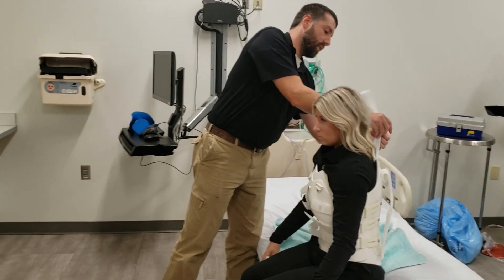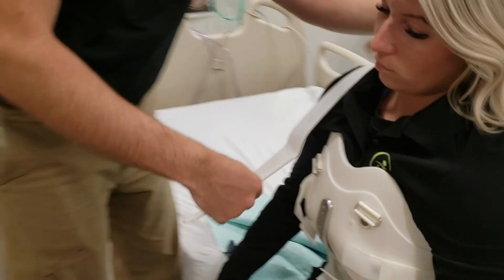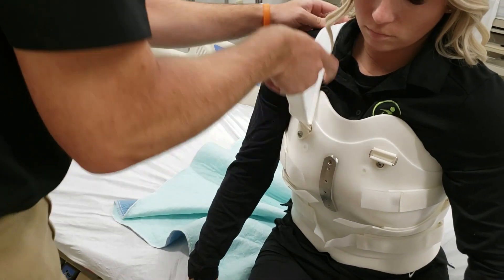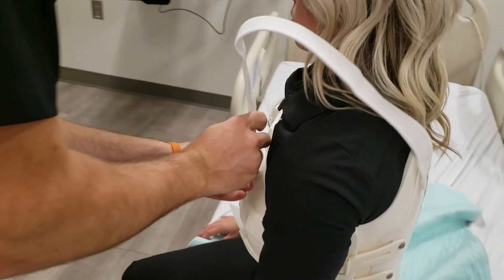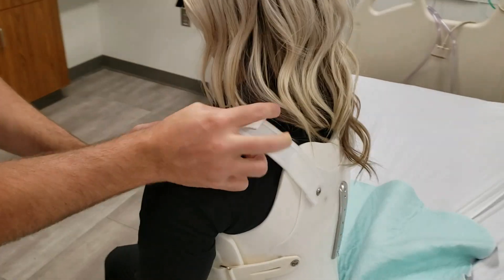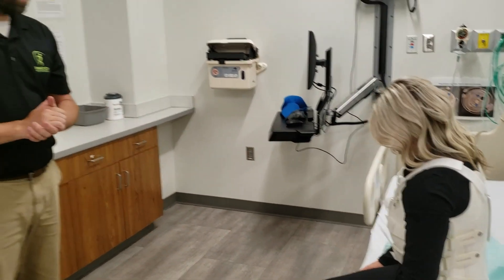I'm going to go ahead and put the shoulder straps on them. And that is how you properly don a custom TLSO.